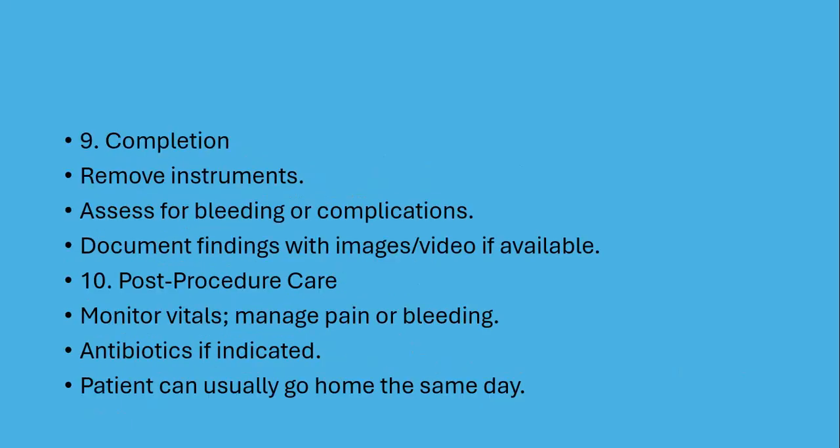9. Completion. Remove instruments. Assess for bleeding or complications. Document findings with images/video if available. 10. Post-procedure care. Monitor vitals, manage pain or bleeding. Antibiotics if indicated. Patient can usually go home the same day.